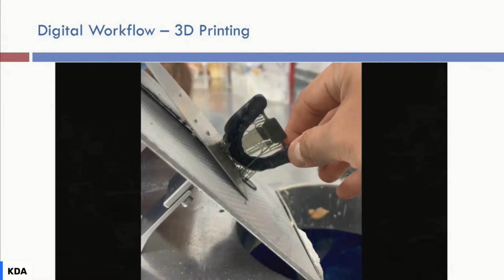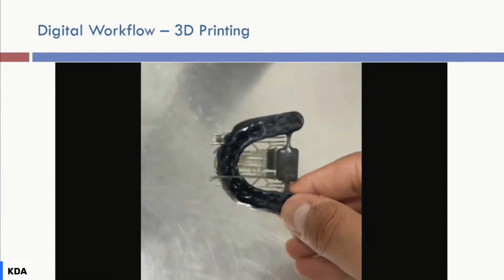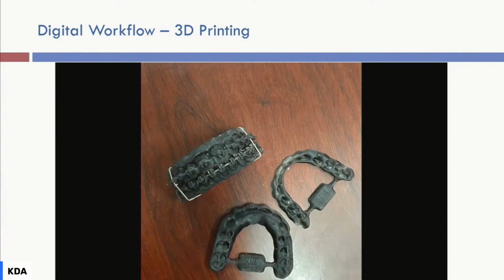We can remove all the extra pieces, and it is ready to be disinfected and used to guide you in the surgery, just to position the maxilla and the mandible in the right place.